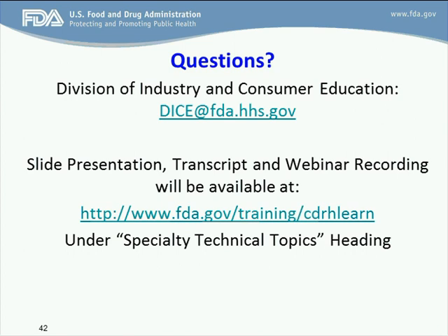Now, the high-level disinfectants and liquid chemical sterilants are FDA cleared. The low-level and intermediate-level disinfectants are Class 1 devices and need to be legally marketed per FDA, but they're also regulated by EPA, so they should be registered by EPA. So you don't have to say in the labeling that the product is legally marketed. We'll look at that when we do the review, but you should specify a type of disinfectant that is legally marketed. Okay, so as long as we specify a brand or something along that line and it is approved, then we're good. Correct. Okay, very good. Thank you.